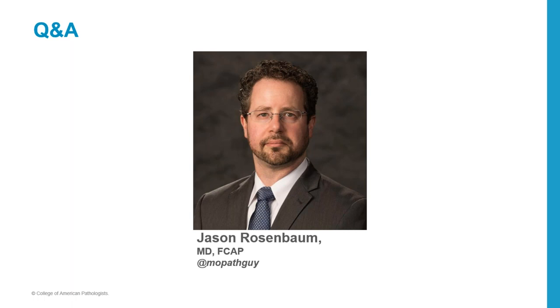All right, let's start moving through the questions that we received. And the first one is, can we use frozen section block to run NGS? You can. The compromise that you're going to make there is in accuracy of the tumor content assessment, and so you run the risk by having a lower grade histopathologic assessment of the material you actually send, not having as much tumor as you thought. So there's a little bit of a risk there, but we do sequence frozen sections under some circumstances at our institution.